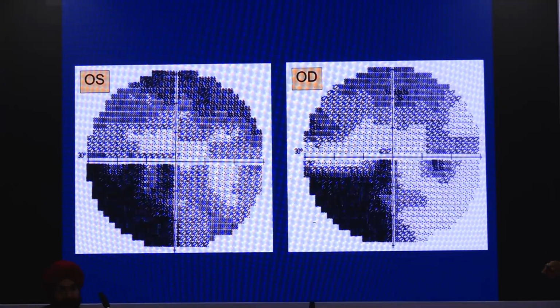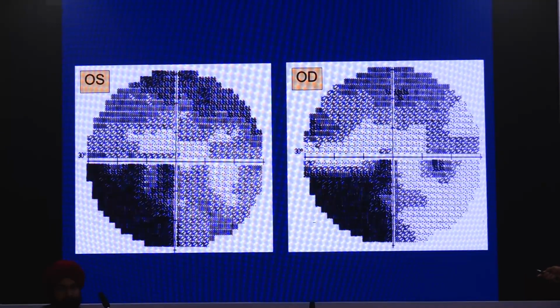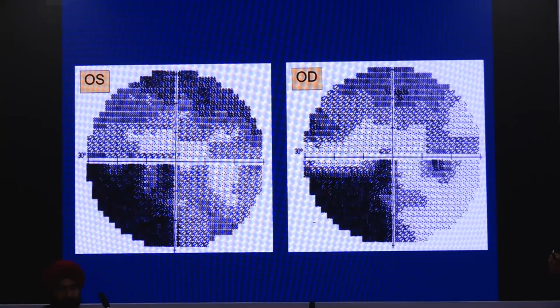We move on and say, okay, this is another example of a visual field defect where there is a visual field problem in both the eyes, which is, by and large, respecting the vertical midline. Please remember, in glaucoma, we look at very specific changes and then look at mean deviation and pattern standard deviation, because that's what will guide us for the treatment. While in neurology, we are only looking at the patterns, because that's what will localize the lesion.